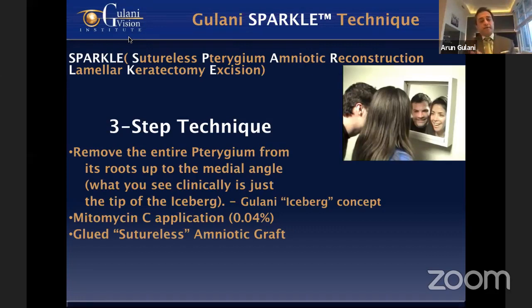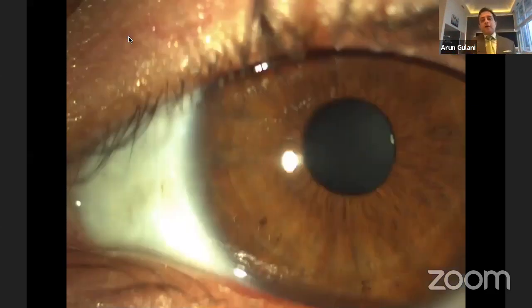Glued, meaning sutureless, and the glue I use is Tisseel glue, no financial interest. I just want elegance. I hate stitches. I want the eye to look great, to move perfectly, no pain, and the patient's vision is also restored to some extent. So this is how patients look the next day.